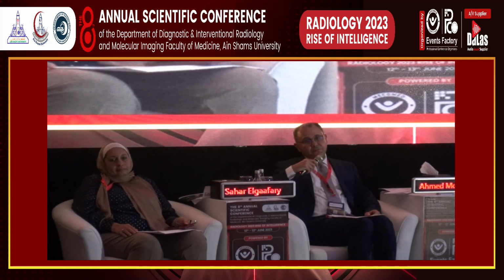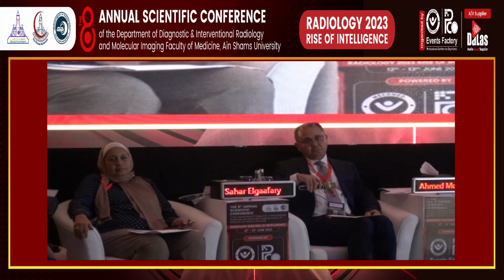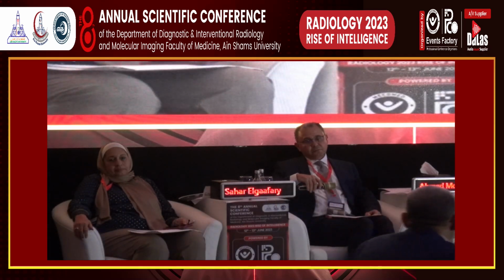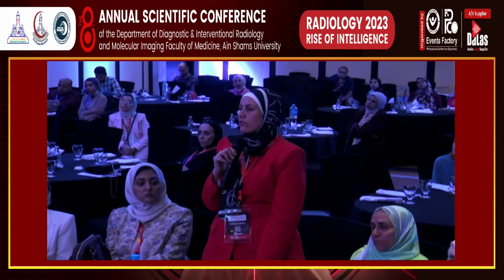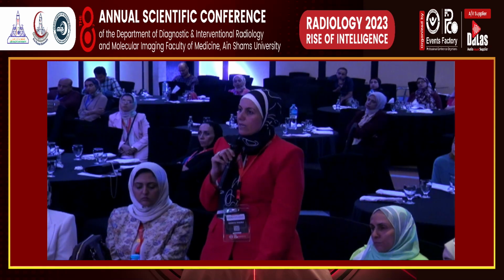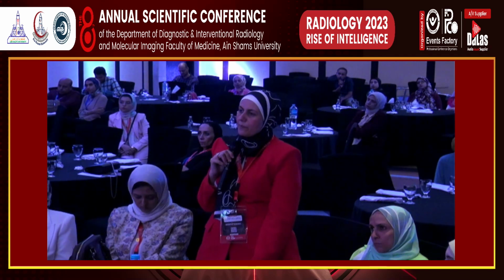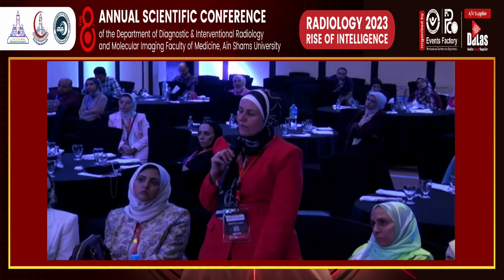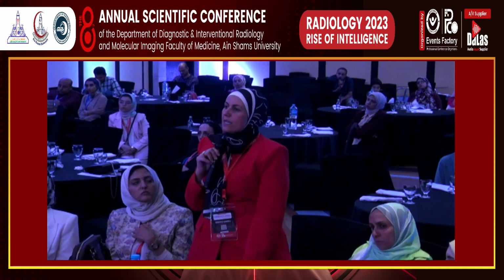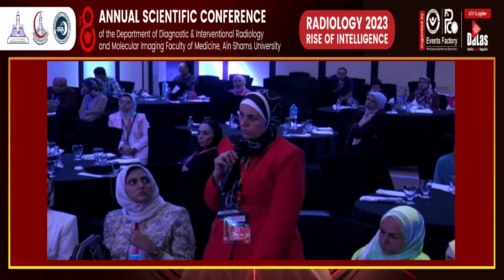الـMRI هيبقى أحسن من السي تي فور إيفالويشن أوف الكونكرنت كيموراديوثيرابي، لأن أنا مش بعتمد بس على المورفولوجيكال إيفالويشن. إحنا كان عندنا ستادي عملنا لها بابليكيشن بالإيفالويشن للديفيوجن، إن إحنا إزاي نجيب الريسبونس بالديفيوجن للكونكرنت كيموراديوثيرابي بعد ما العيان إن هو كان بوردر لاين ريسكتبل واتخذ الكونكرنت كيموراديوثيرابي وجه بعد كده فور السيرجري، وكانت الريزلتس أدكويت إن هم فعلا جابوا ريسبونس بيزد أون ذا ديفيوجن إن سبايت إن المورفولوجيكال داتا والسايز بتاعت التيومر كانت أولموست نوت تشينجد.